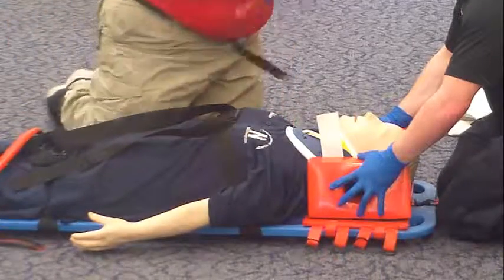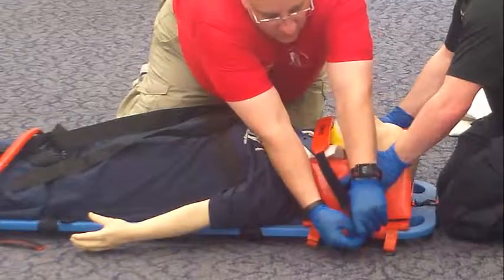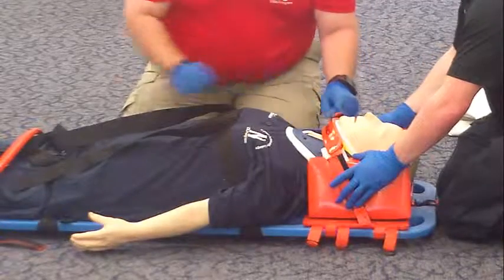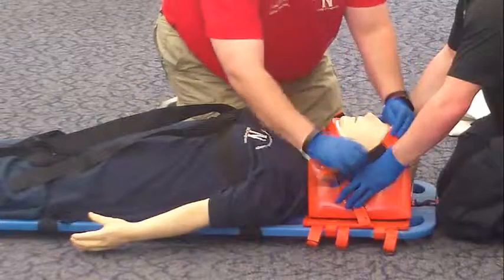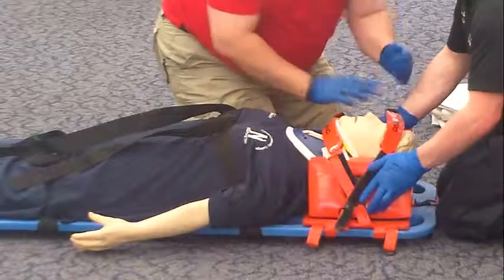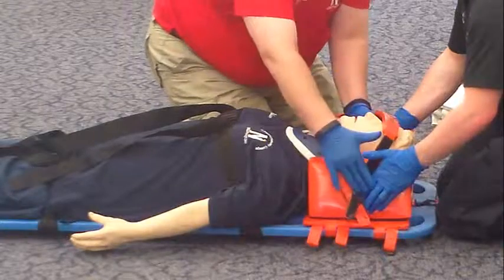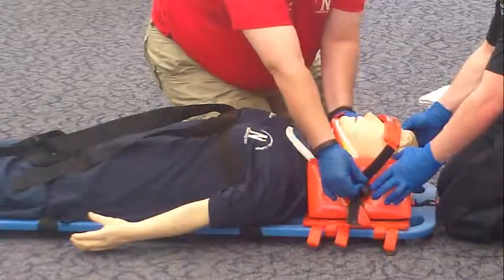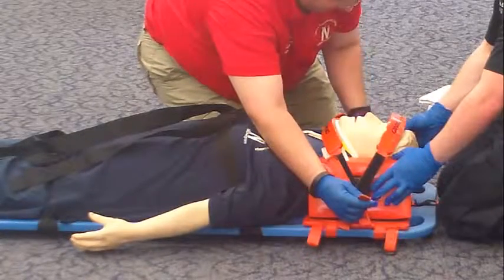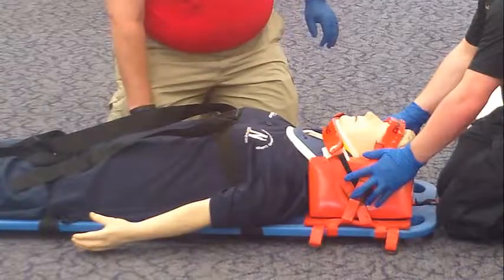I will now apply the chin and forehead straps to secure the patient's head. I will slide your hand out to the strap. I have the head. Just slide your hand out — hold it. I will secure the head. I will also secure the hands together so that they would not flop up.